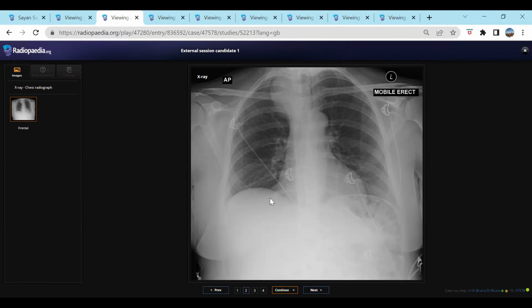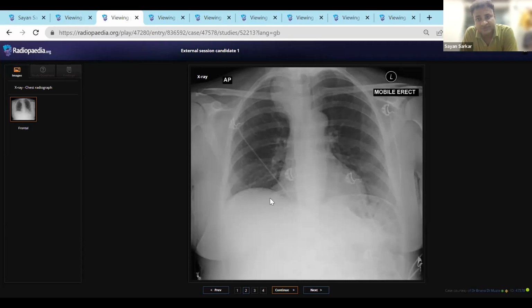In this case, I can offer an MRI of the patient to look for the lesion. If it is a posterior mediastinal lesion, I am suspecting a neurogenic tumor. But you just said there is no ancillary feature supporting a posterior mediastinal lesion. What was your other differential? The other differential was a neck mass, could be extending from the neck.